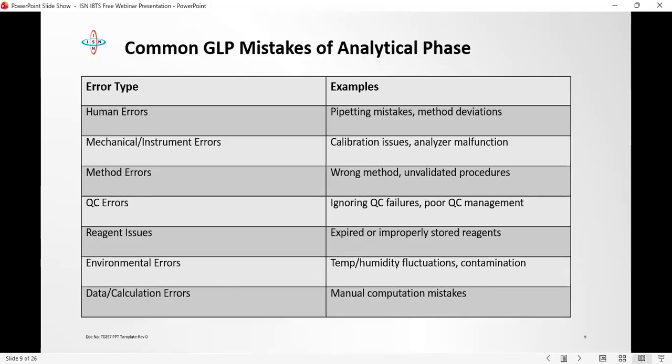There are some parameters that you run quality control on, and they will pass today. Tomorrow you might use that same quality control material on that same parameter and it will fail. That's because of the way that parameter behaves. So it's very important that we take note of all of this, go through our IFUs, and make sure we understand the behaviors of all of these reagents.